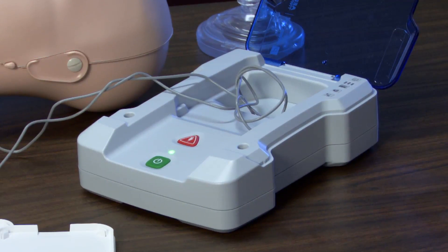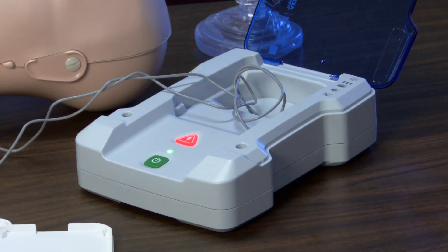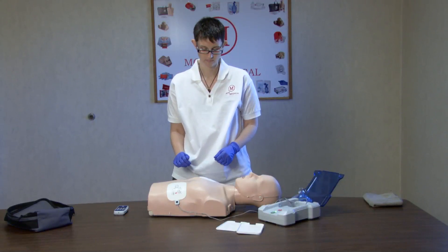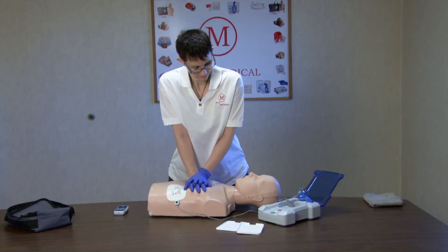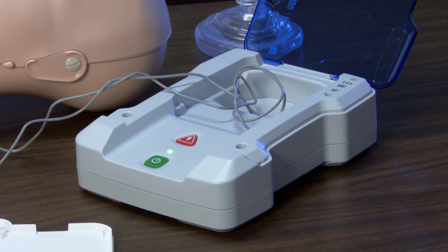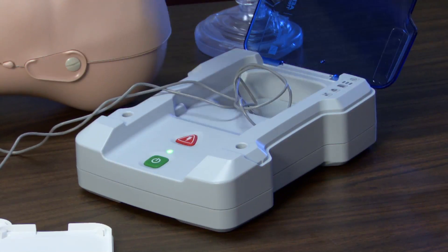After analysis, depending on which scenario was chosen, the unit will advise to shock or not shock. Press the flashing shock button. Shock delivered. A pause follows, giving your students a chance to check for obvious signs of life or to continue with CPR. After the recommended number of cycles, the unit will again analyze and proceed as indicated for the selected scenario.